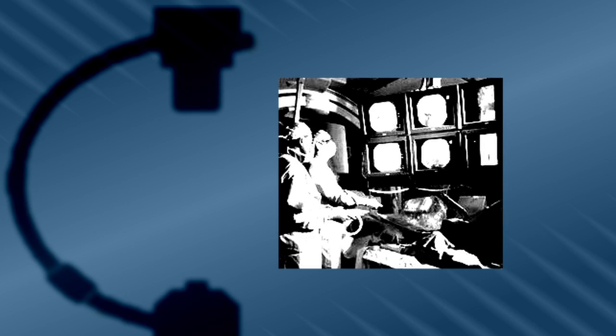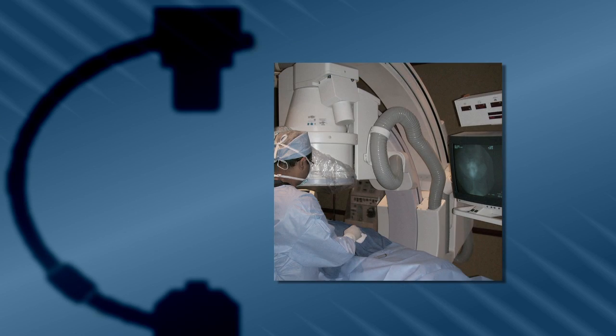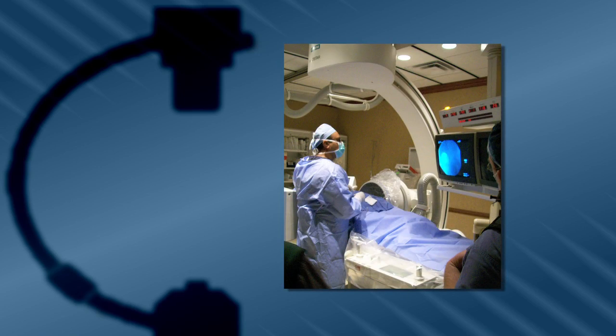Basically it's done through a needle that we guide under X-ray vision, and once we get it into the fracture, we put medical superglue or bone cement in a liquid form that hardens, and within a few minutes it can take away a person's pain. It's really a medical breakthrough in the way that it can do that. And it takes about 10 to 15 minutes to perform. The patient has a Band-Aid afterwards and oftentimes can walk out of the recovery room, whereas previously they may not have been able to stand up.